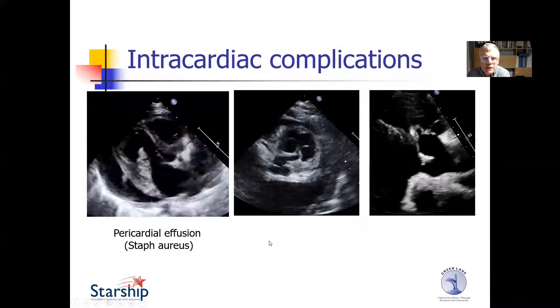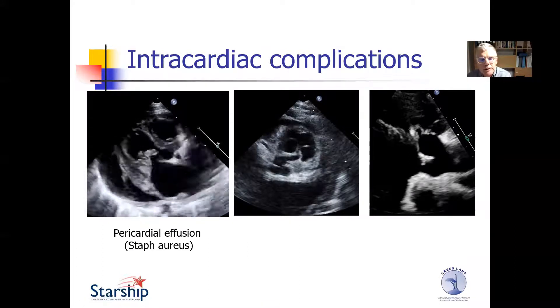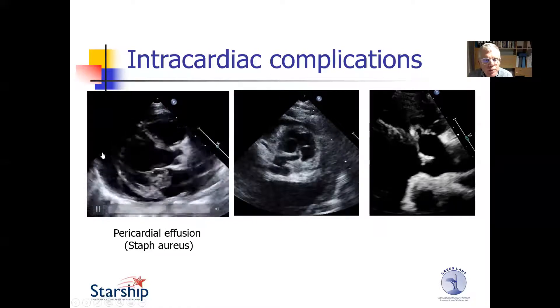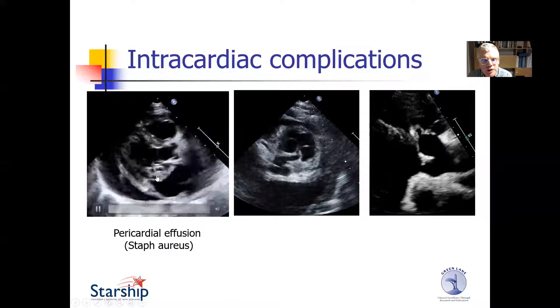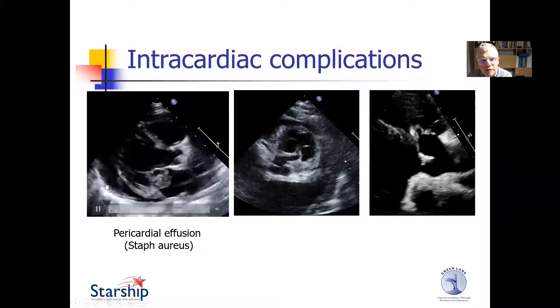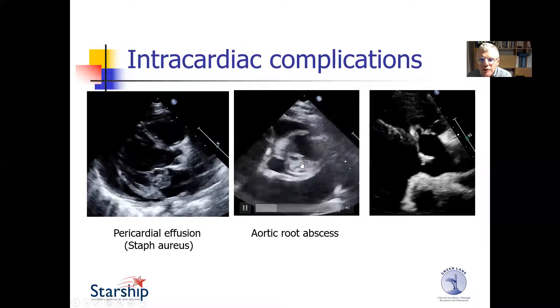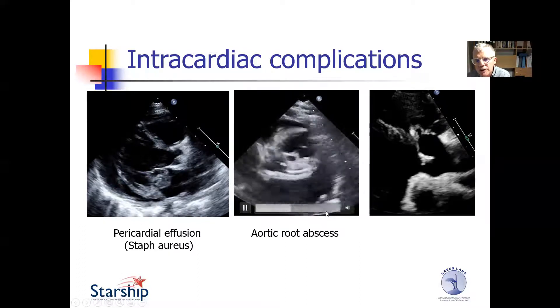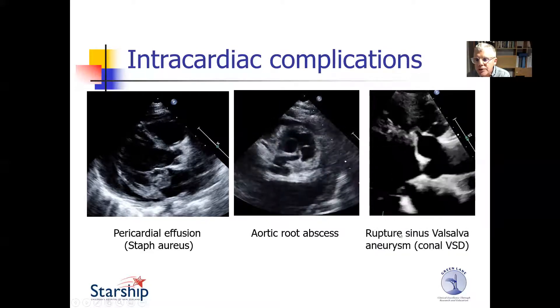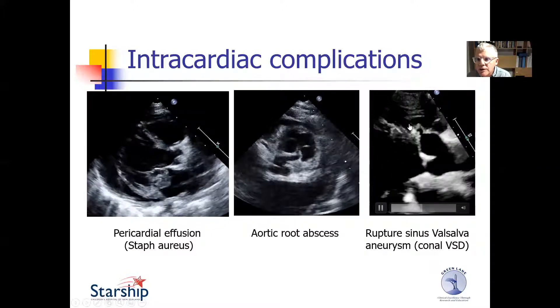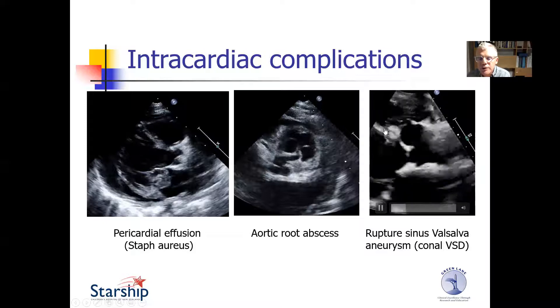Intracardiac complications of bacterial endocarditis are quite common. Pericardial effusions can be seen in rheumatic fever and the other arthropathies. But in this patient with bacterial endocarditis with staph aureus on the mitral valve, there was also infection in the pericardium. This is an aortic root abscess — the aortic valve is here and this is the abscess — it's pretty pathognomonic of bacterial endocarditis. And this patient has a conal ventricular septal defect with endocarditis on the VSD and the aortic valve, with rupture of a sinus of Valsalva aneurysm.